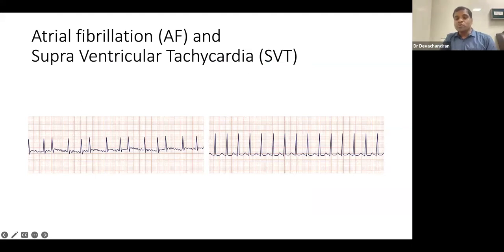Number 1. Number 2, what is the ventricular rate? 2 big squares. So ventricular rate is 150 per minute. If the ventricular rate is above 100, it's a tachycardia. There is electrical activity. It is a tachycardia. Is the QRS regular or irregular? As you can see, the number of big squares between R's are regular, only 2 between all the R's. So it is regular tachycardia.